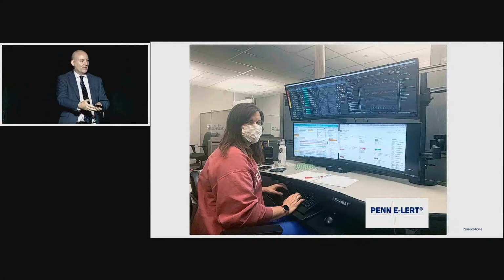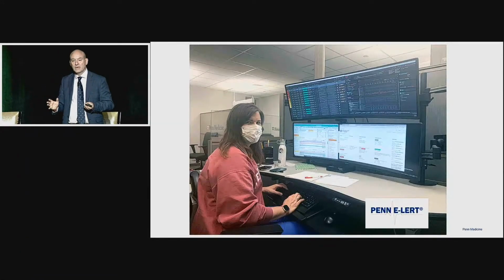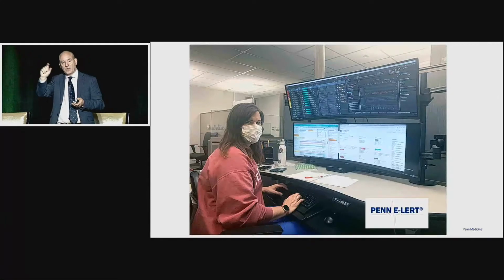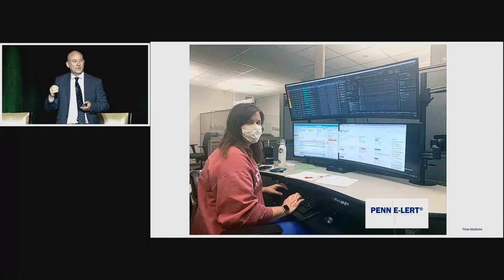And Careline, which just got presented by Suba, is a fantastic graphical interface. We use that a lot at Penn. So I've effectively done a little bit of what she's done, but in the EMR in the Tele ICU. The whole idea is to stop the clicks and just see the data and visualize the delta. So that's really what this is about.